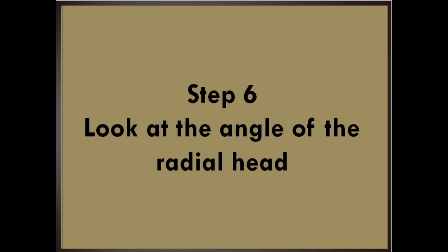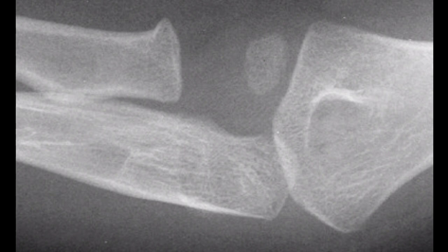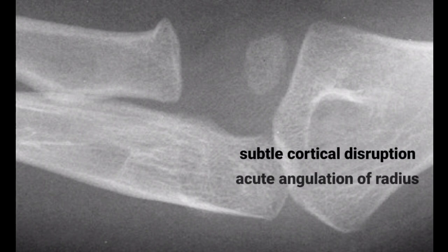Step 6: Look at the angle of the radial head. Look for any subtle angulation at the radial head, which can indicate a fracture. Look for subtle disruptions in the cortical contour. On this radiograph, notice how the radius bisects the capitellum on this view. However, there is a subtle cortical disruption and acute angulation at the superior aspect of the radial head, indicating fracture.